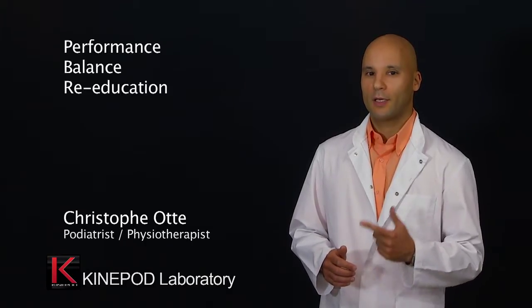They can be used in the following applications: Performance, Balance, Re-education, Prevention, and Maintenance. In order to use these tools correctly, I propose a few tests on posture and movement that will enable you to evaluate the therapeutic needs of your patients.